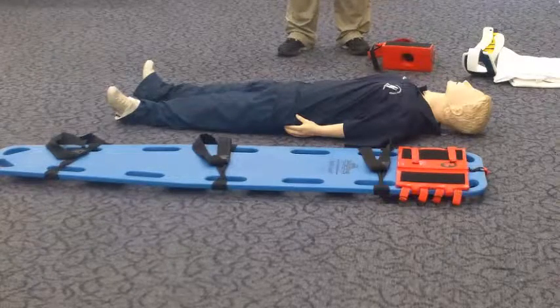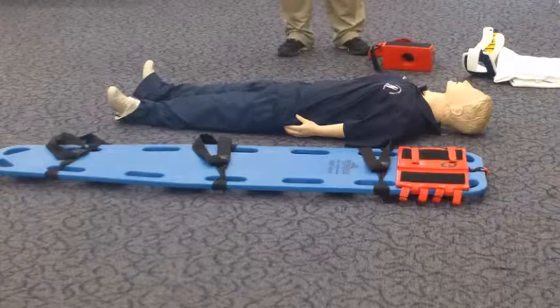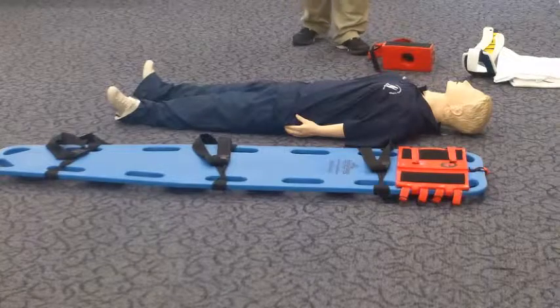You will have 10 minutes to complete this procedure. Do you have any questions? No, I do not. Your time will start when you approach your patient, and when you have finished, please indicate so.